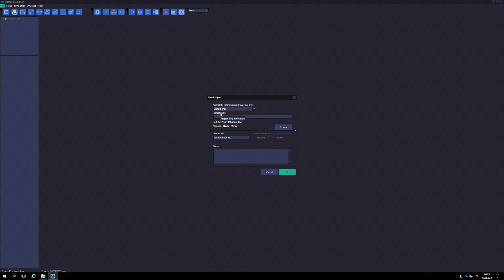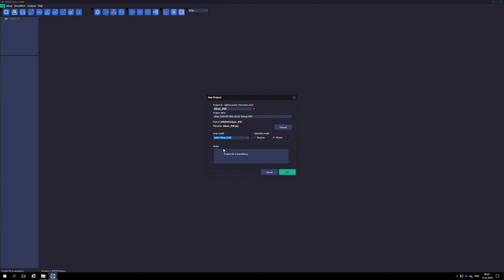In the project name field, we enter any information that helps us remember what we have done. More abundant information can be entered in the notes field below. Now we choose the Linac we want to simulate from the drop-down menu. In this example we are going to simulate the Clinac 2100 C/D in photon mode.